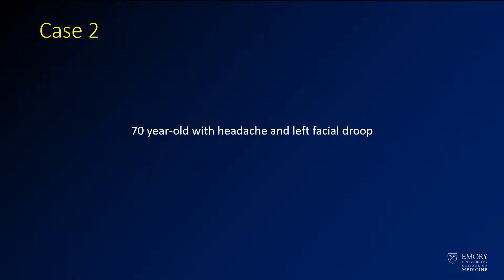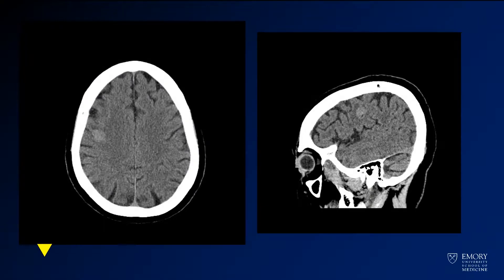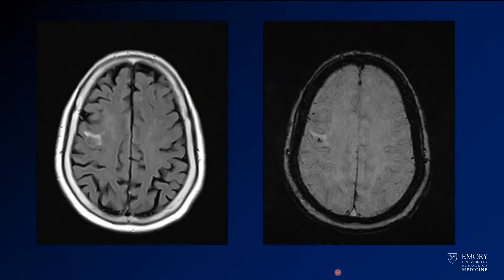Hemorrhage case 2 is a 70-year-old with headache and left facial droop. Here we have a couple of images from a head CT. We have an axial image on the left showing a little bit of a subtle hyperdensity here in the posterior aspect of the frontal lobe. Here on the sagittal reconstruction you see it there, kind of just above the sylvian fissure. You're concerned that that's a hemorrhage.